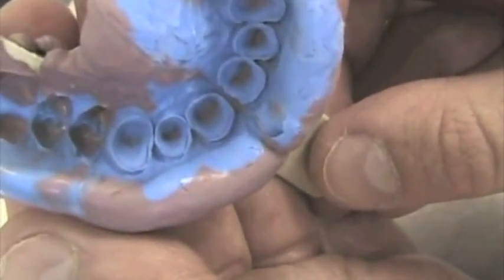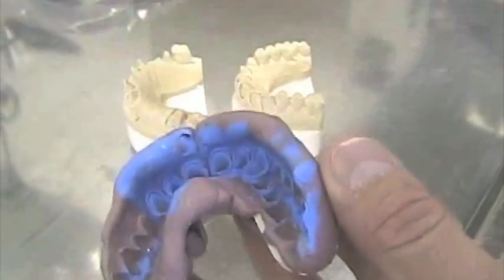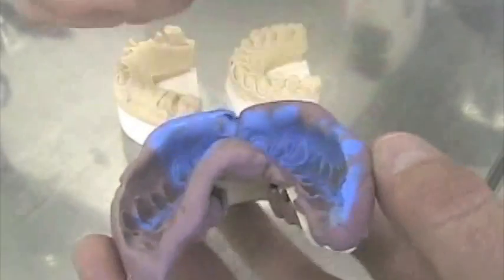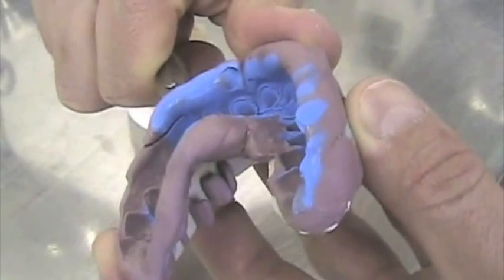So we are going to focus on those when we pour it. I have a blade. I'm going to cut the excess of silicone, that part there, without obviously touching the margins and the preparations. I'm going to do it now.